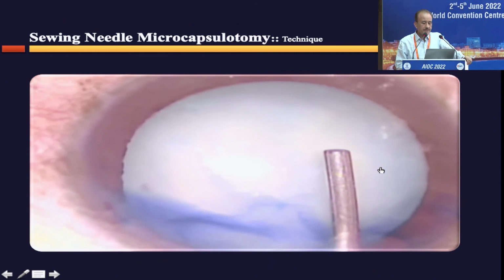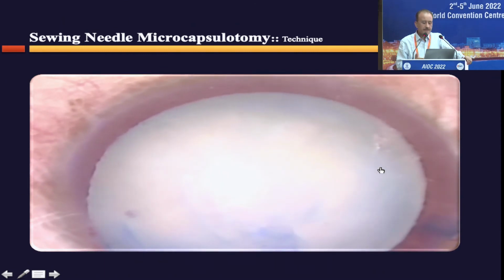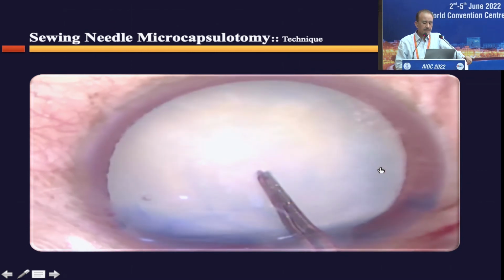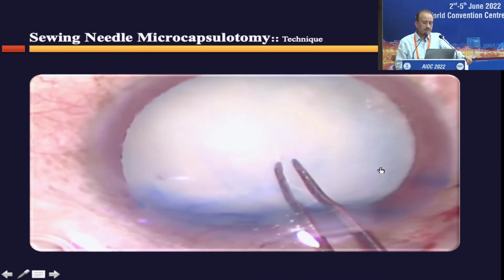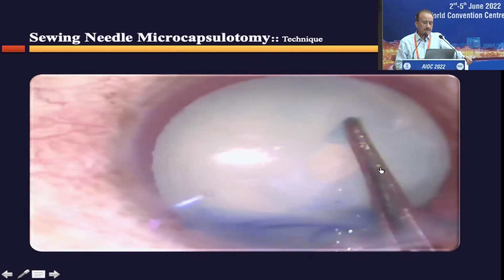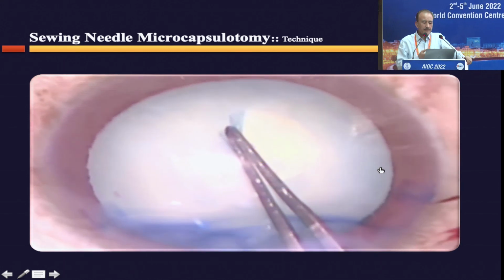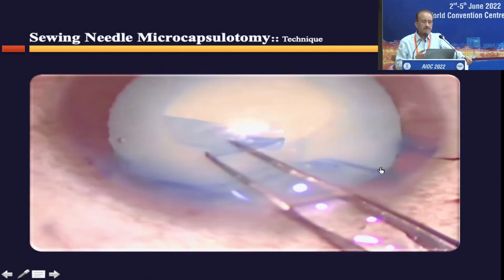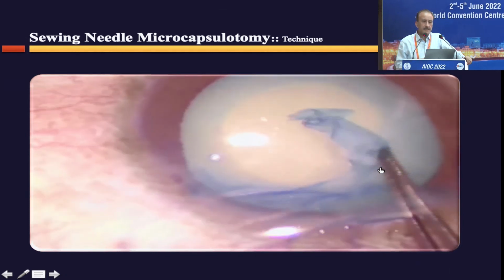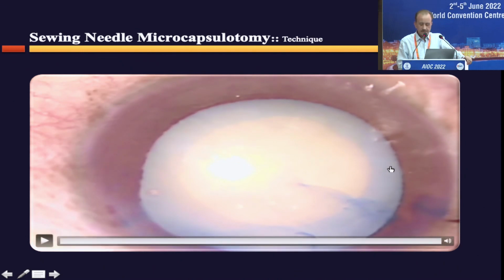And then once the puncture is made, with the help of the air cannula, you can evacuate the fluid out of the capsular bag. As I'm doing here, tearing the capsule now from that hole, then you raise the flap and complete the capsulorhexis. You do not have to worry, because the capsular bag is now fully decompressed and the pressure is very low. You do not have to worry about the extension at all, and you can complete the capsulorhexis of whatever size you wish in your situation.